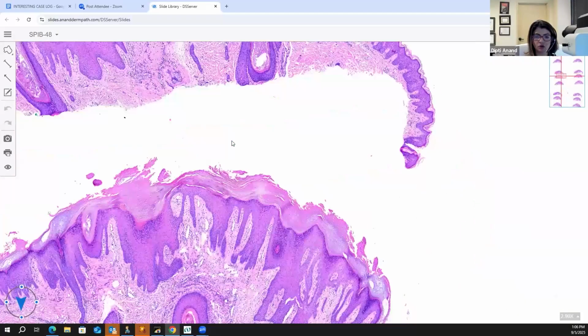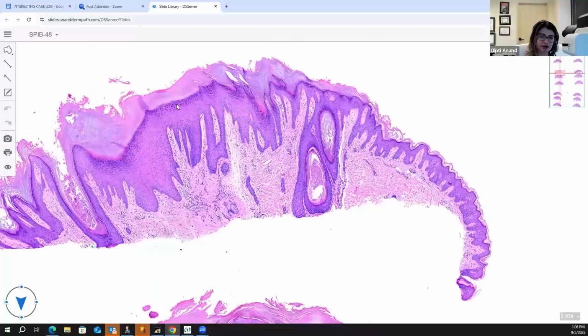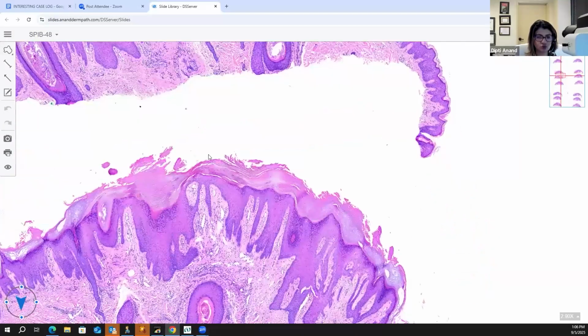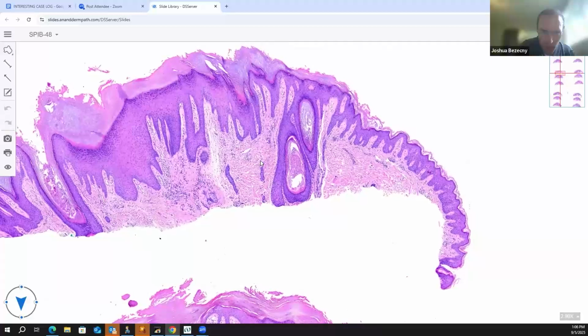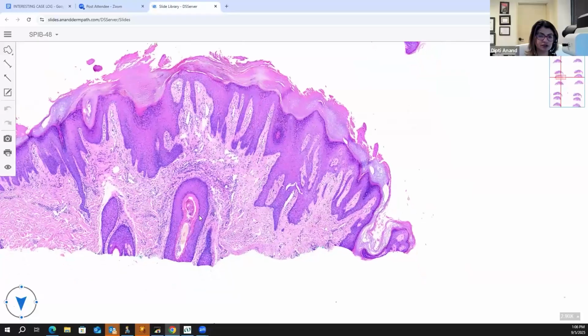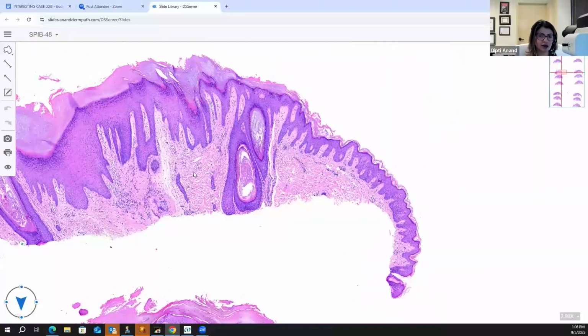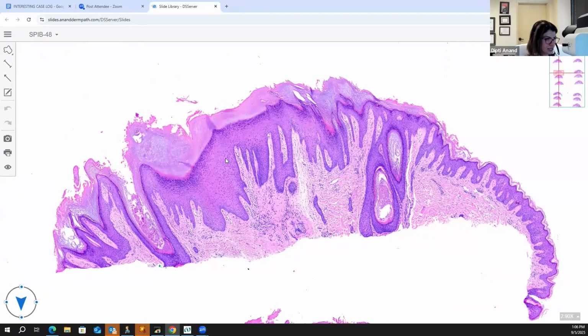Yes. And what is the most diagnostic feature of prurigo over here? Because the acanthosis and hyperkeratosis, you can see even in a wart, right? So why wouldn't you pick a wart? Maybe the dermal fibrosis. The dermal fibrosis could be there in a wart as well. Maybe some follicular plugging as well. It's not the plugging, but it is the hypertrophied follicular infundibular unit. That is what is called the hairy palm sign, because the thick epidermis looks like acral skin, right? But it is not. It's because everything is thick.